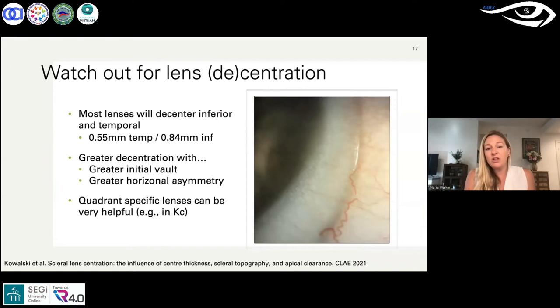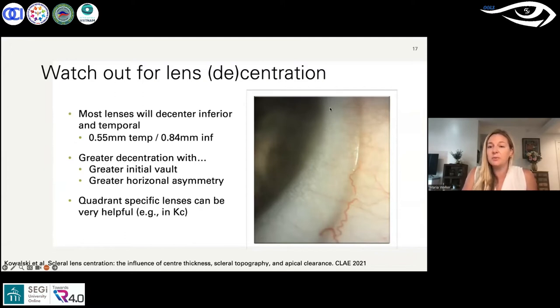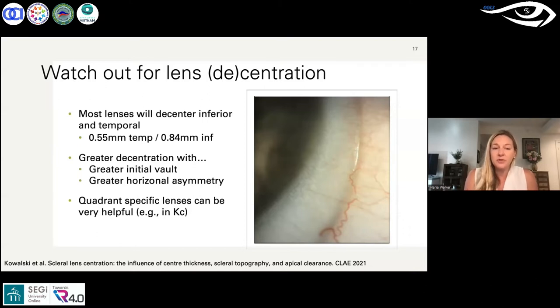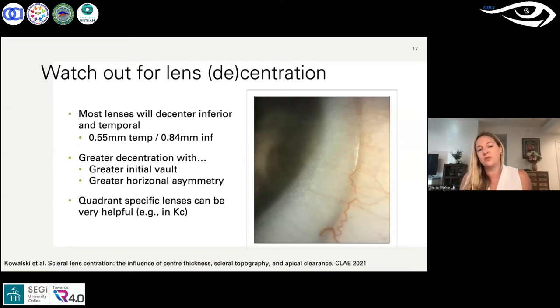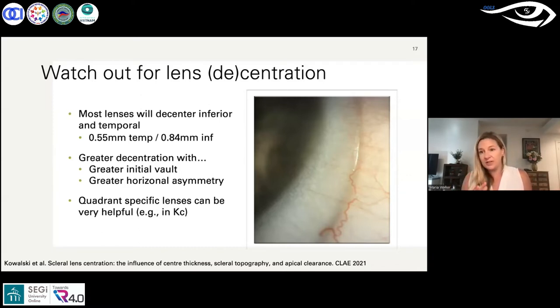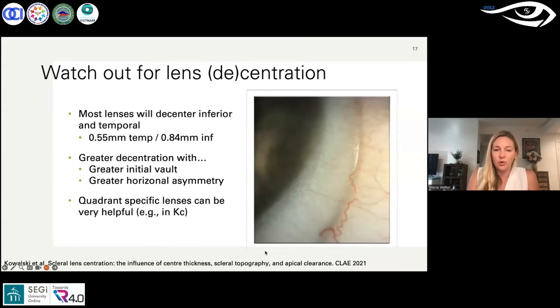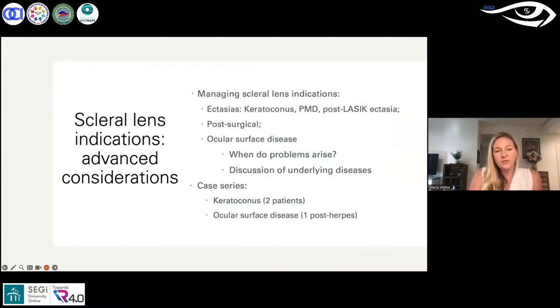Watch out for lens de-centration. In this patient's case, looking superiorly you see less of the lens versus inferiorly you see more, indicating the lens is de-centering inferior-temporally. A published paper found about half a millimeter of temporal de-centration and three-quarters of a millimeter inferiorly on average. This can be greater when you have too much vault or a lot of horizontal asymmetry. Designing a toric lens can help center the lens better. Scleral topography, which we'll discuss next, can allow even further customization.